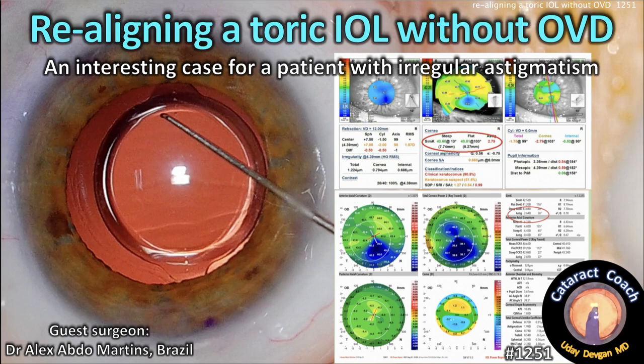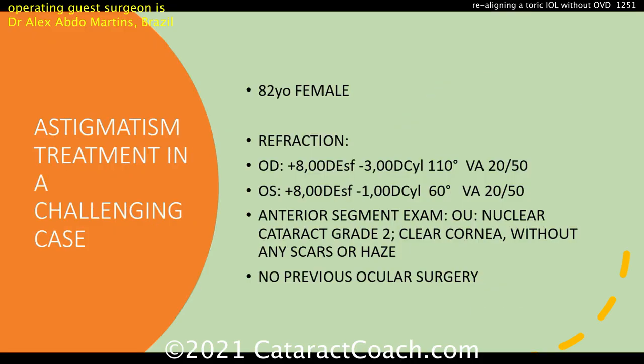CataractCoach.com — realigning a toric IOL without viscoelastic. An interesting case for a patient with irregular astigmatism. Our guest surgeon is Dr. Alex Abdo Martins, a fantastic surgeon from Brazil. Love watching his videos and watching him operate.